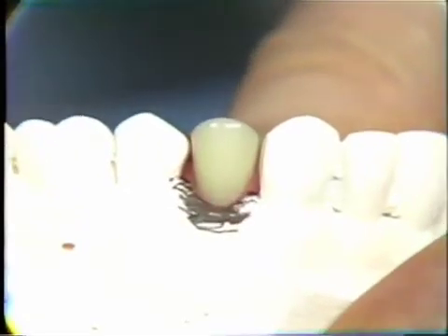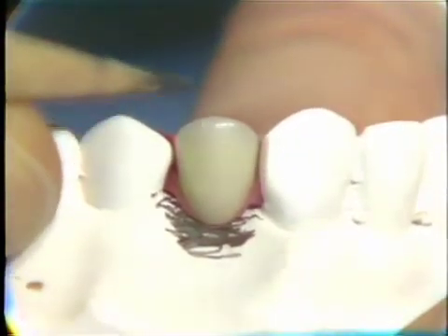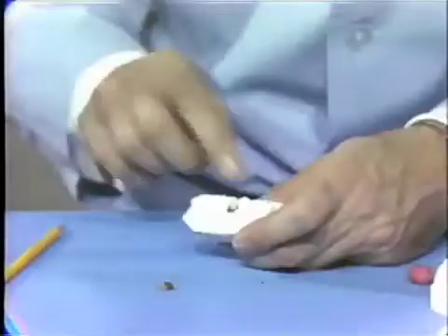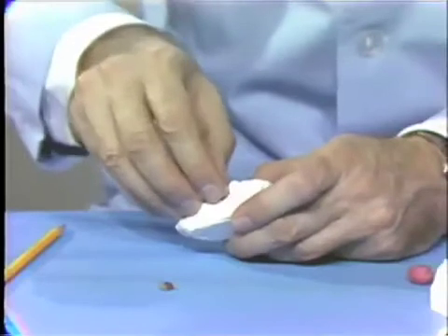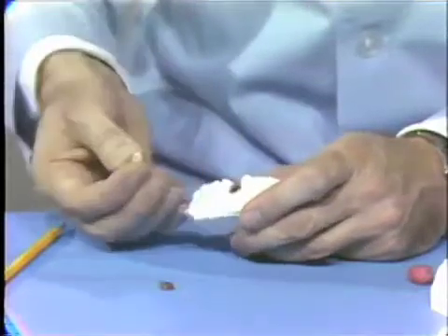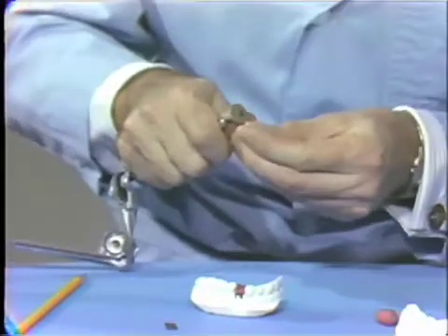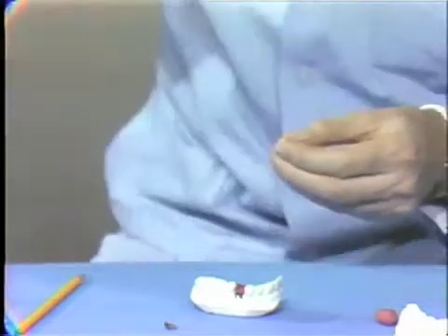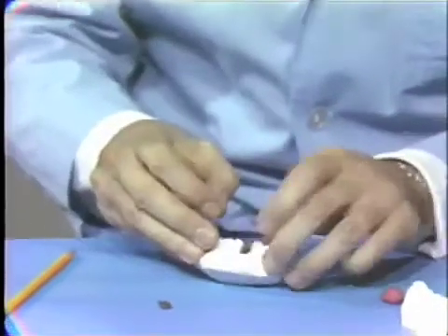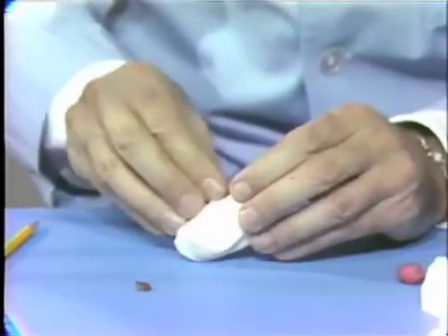So having decided on that sort of position, we're now going to grind this surface away so that it slowly seats down until we've got room up here for 1.5 millimeters of gold and the table up in that region. The utility wax or the modeling clay back here enables you to pull this away and then return it back to approximately the same position again after you've ground it. It has some more pencil marks on it which I'm going to grind off. Then return it into position again. Pick up some more pencil markings and grind these again.